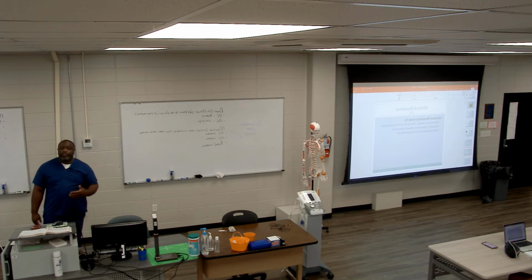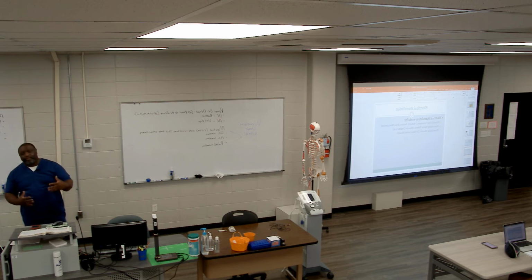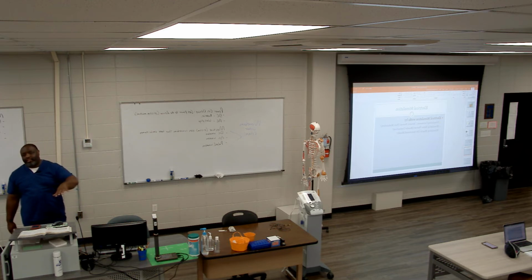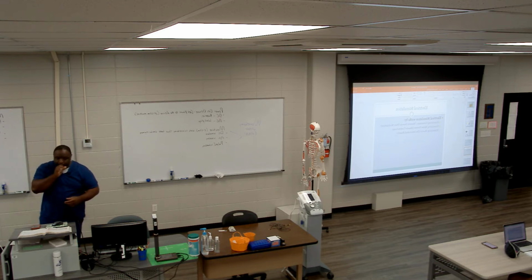Or we may use it to release trigger points. So there are a lot of different reasons and ways we can produce muscle contraction from E-Stim. We'll get into all of those, I promise you. You'll know what each of those things I just said means.